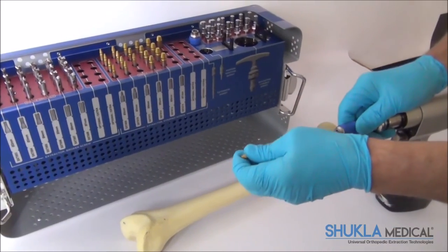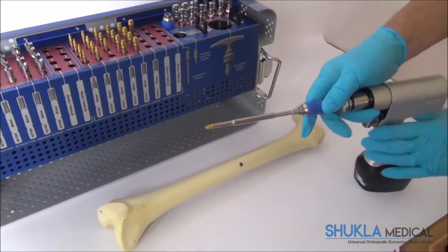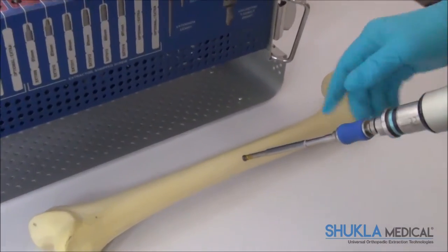Then the extractor is turned in a counterclockwise direction over the broken screw, until the threads inside the extractor engage.